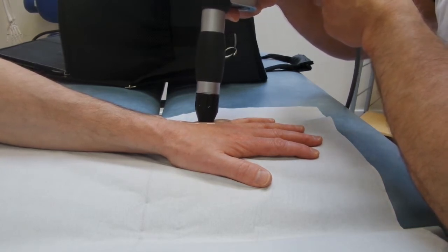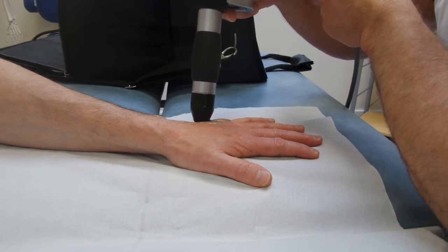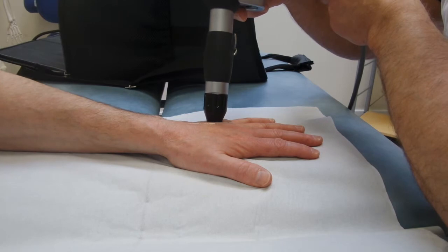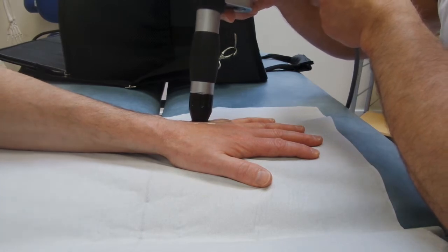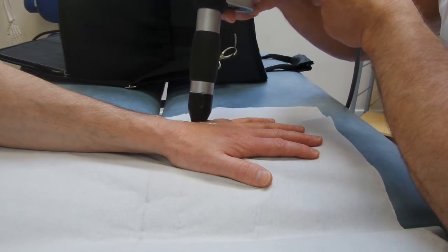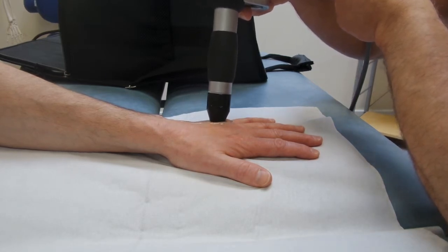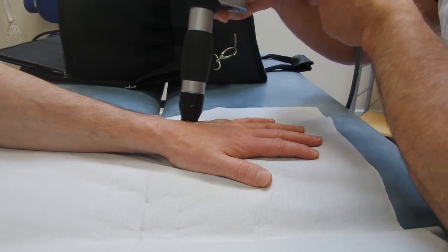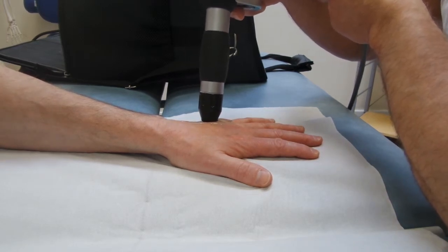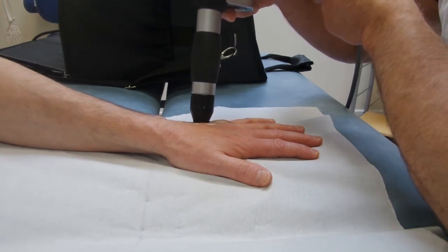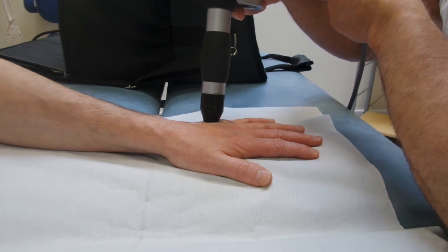Overall there has been some vast improvement. It's interesting that this patient has actually had a lot of treatment: deep massage therapy, ultrasound therapy, laser therapy, exercises for strengthening and stretching to try and ease off the problem. And so far nothing has worked. This third session of shockwave here is already seeing good improvements and should continue to do so as long as the scar tissue continues to clear.